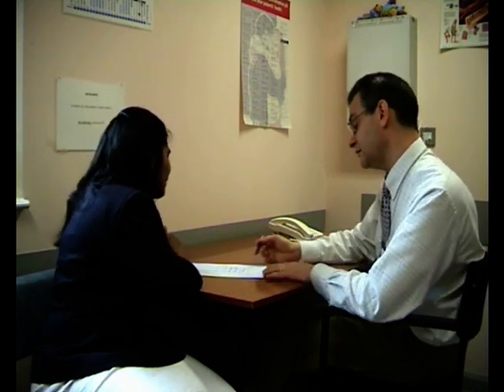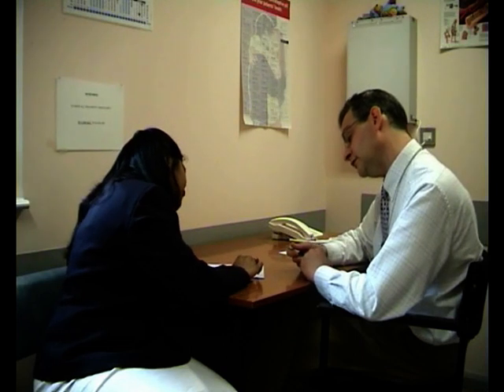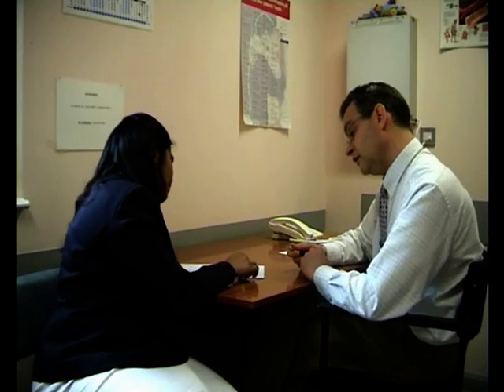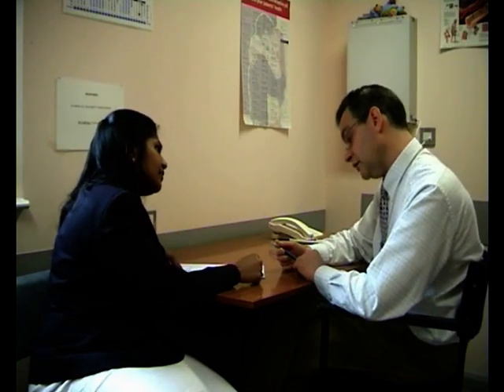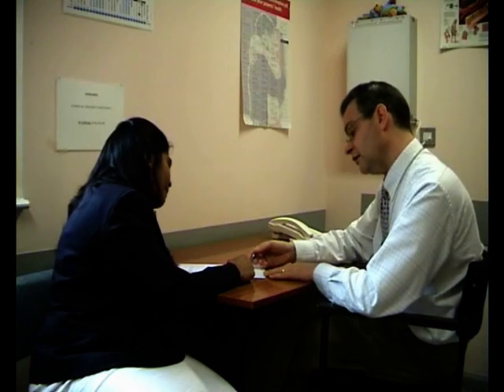So what would be normal for a lady? Anything above 15 we'd probably accept for a lady, that's right. And the volume is 312. That's right. So we put in 333 and she voided almost all of that. So would you say that her voiding looks normal? It looks normal.